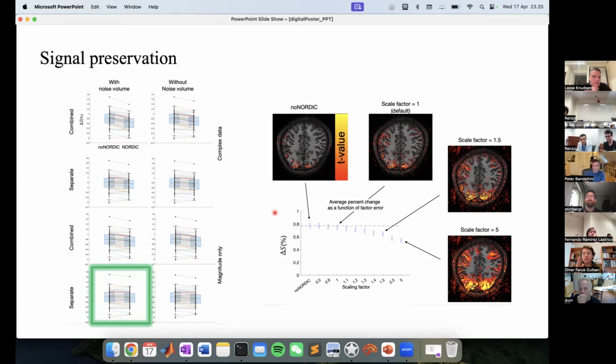So it is determining the cutoff that zeroes out the components after a singular value decomposition. Okay. So higher values means that it is zeroing out more components, so it becomes more aggressive. I see. Okay.